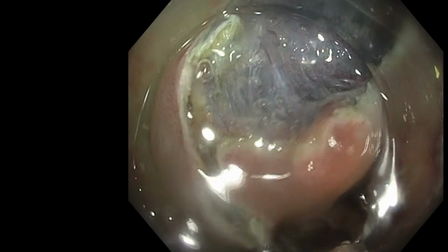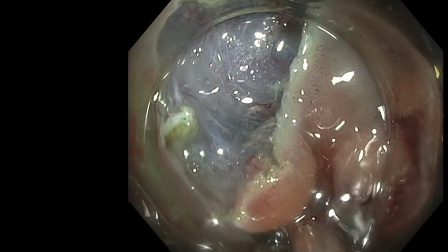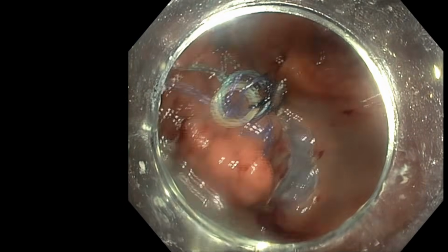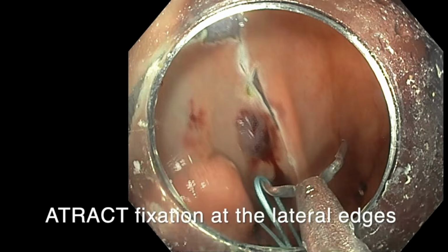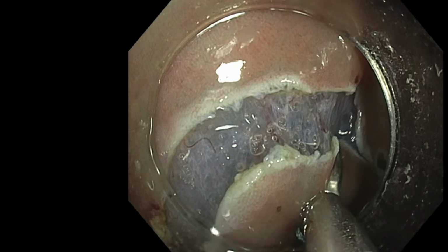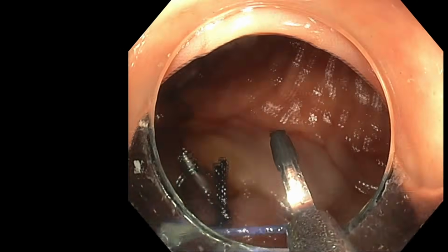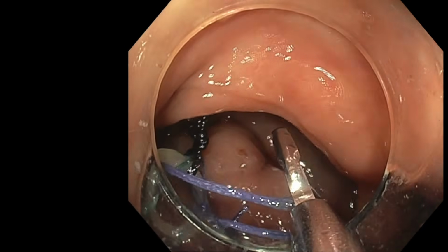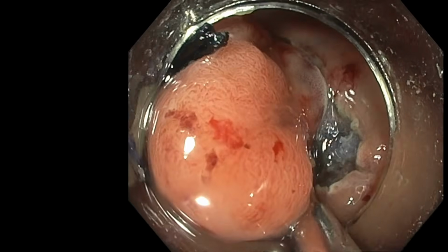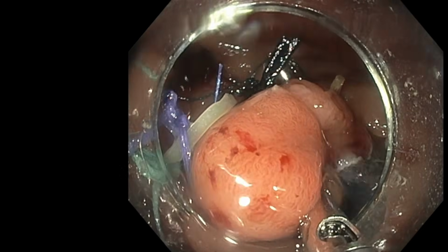Once it's done, I fix the device on the oral edge, on the anal edge for the second part, and on the two sides to have a kind of four polar traction on the two edges and on the two sides of the lesion. You will have a first traction thanks to this 4-point traction to the center. It will expose the margins of the lesion, facilitating the trimming and the access to the submucosa.